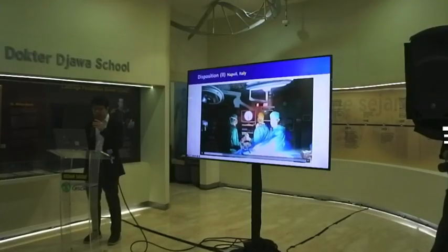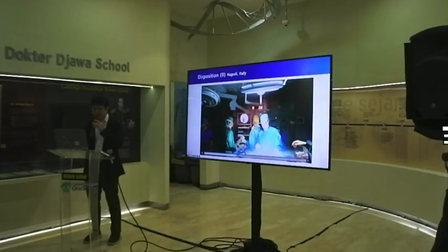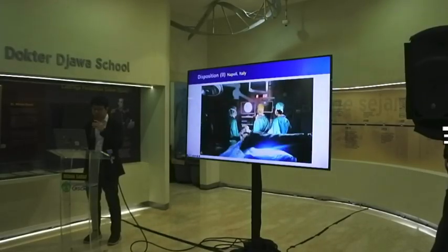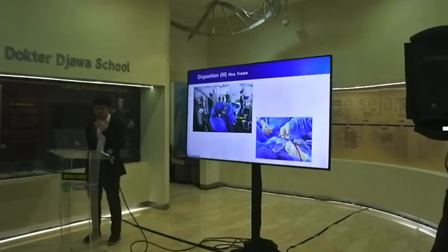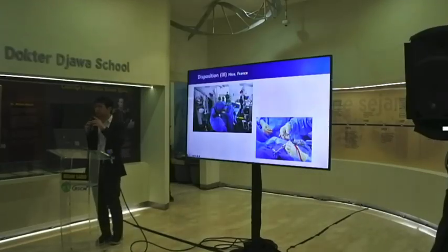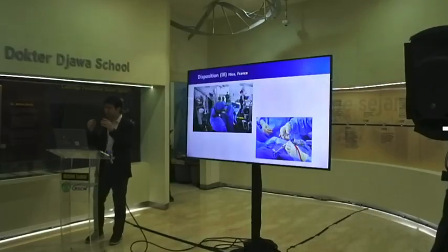You see the operator is here and the scrub nurse is here. And this is France: the operator, assistant, and scrub nurse. If you have some experience in handling surgical instruments, you may feel very uncomfortable at first, because the hand of the assistant and the hand of the operator have some fighting.